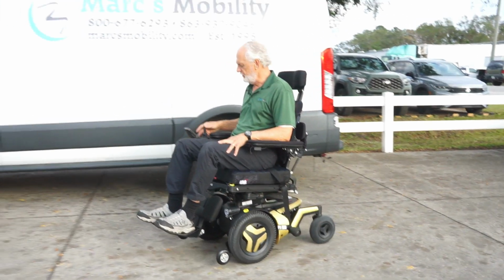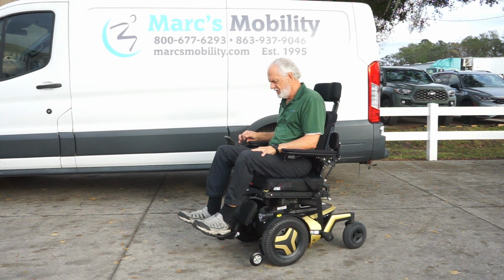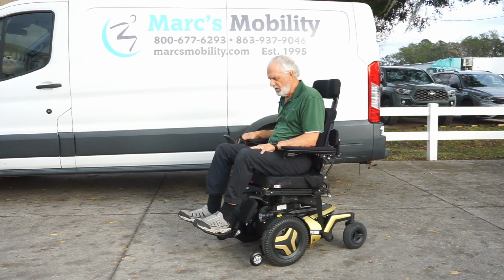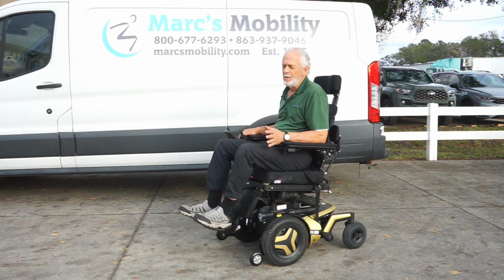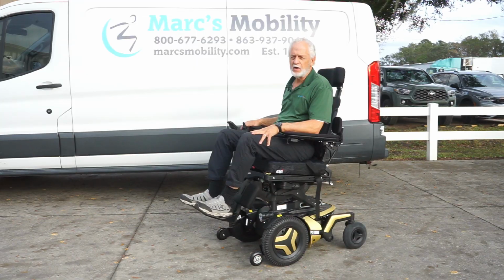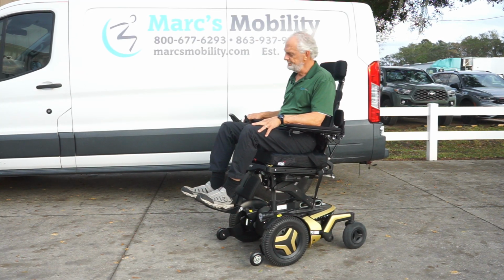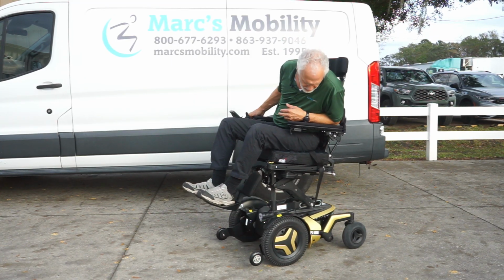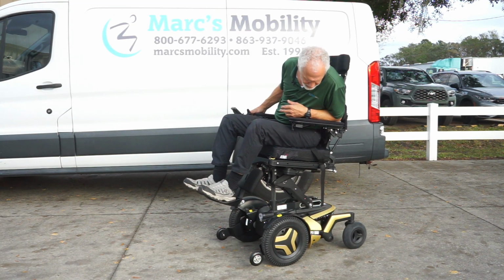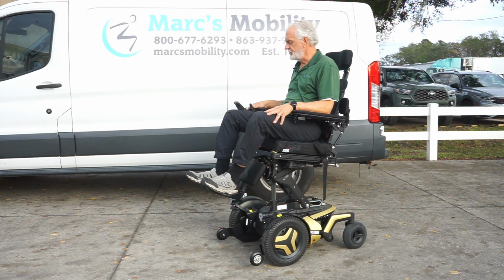And it's very smooth. I'm going to elevate the seat right now so you can see the seat lift going up. Now if you're going to use the seat lift, please, inside, malls, sidewalk, flat surfaces. These are nice chairs, but we do have to take care of them. So I think this seat is almost all the way up. Doesn't take long, does it? So we're all the way up 12 inches now.